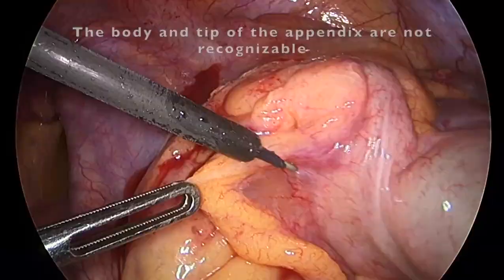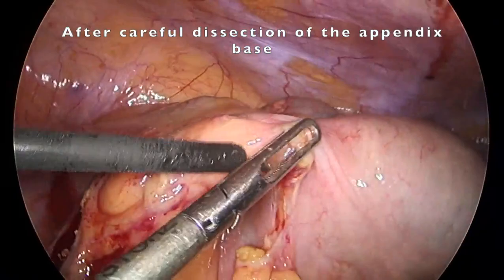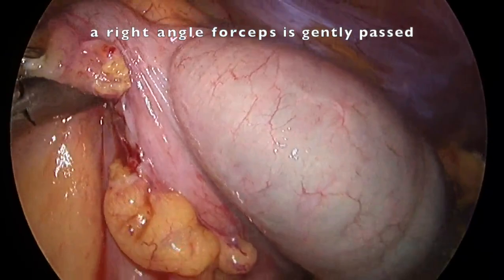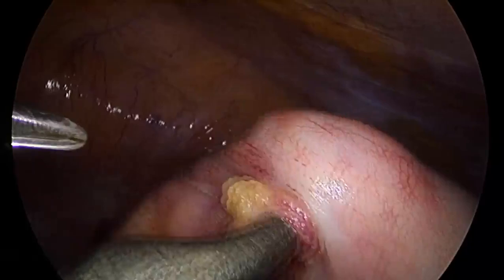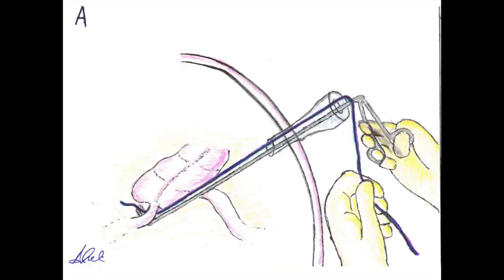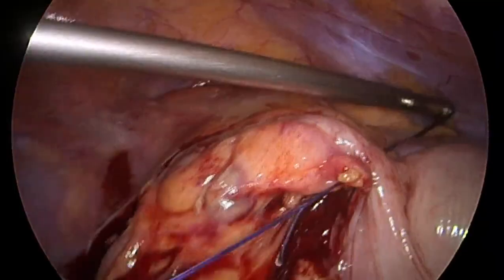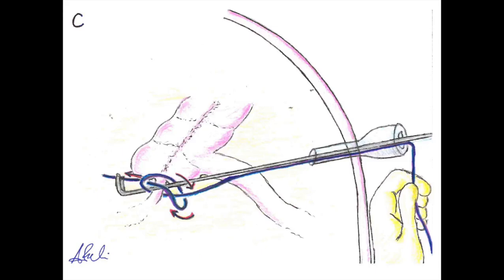Again, in this setting, performing a retrograde appendectomy can be the safest option. After careful dissection of the appendicular base with a right-angle forceps or a Maryland dissector, a braided tie is passed and tied with an intracorporeal knot.